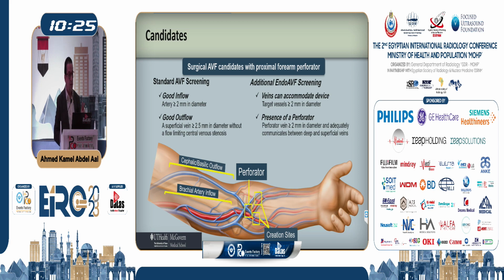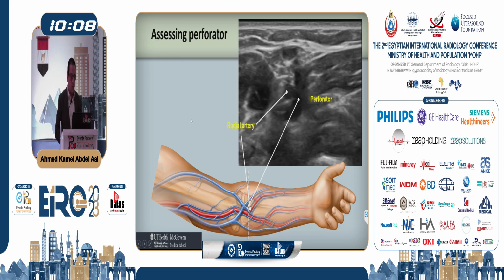It's the rule of 2 millimeters. So the artery, which is the ulnar or radial artery that you're going to use for the creation, should be 2 millimeters or more, of course. The vein should be 2 or more millimeters. The perforator also should be 2 millimeters, and the outflow vein should be 2.5 millimeters or more.